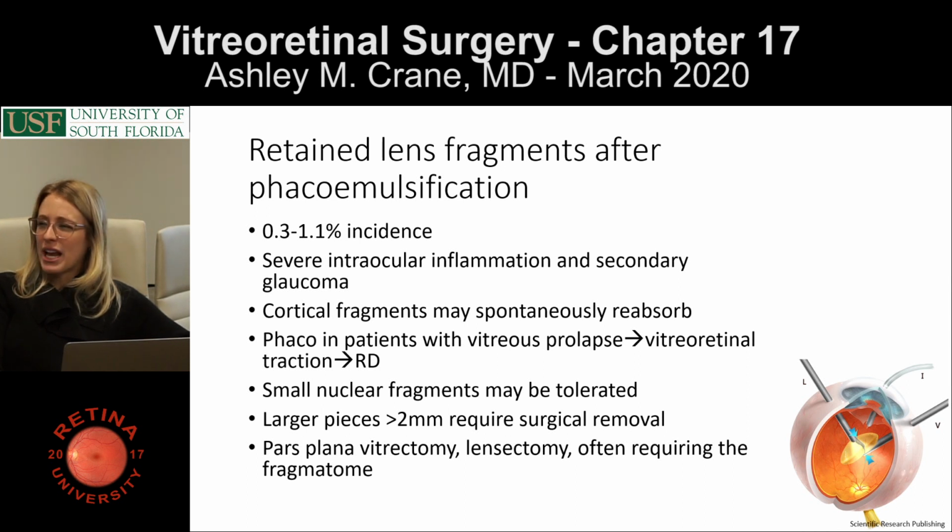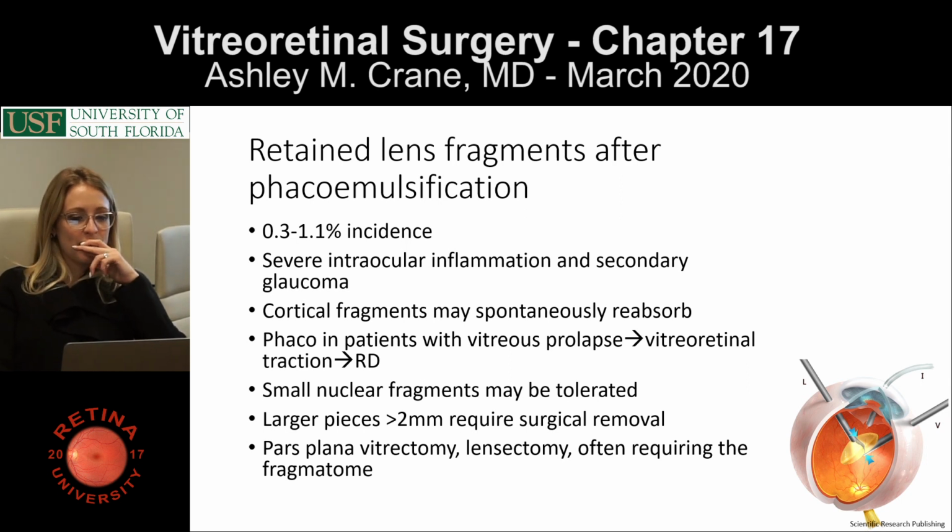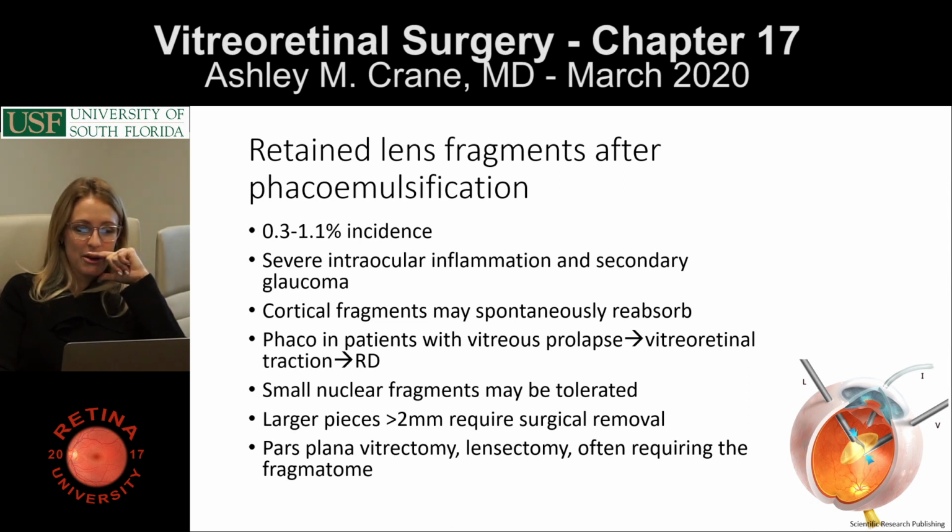That was mostly for IOL cases where they wanted to get a good anterior vitrectomy and they wanted to use a scleral tunnel. Anyway, I don't think it's a common thing for an anterior segment surgeon to go through the pars plana. I don't think it's a good idea.